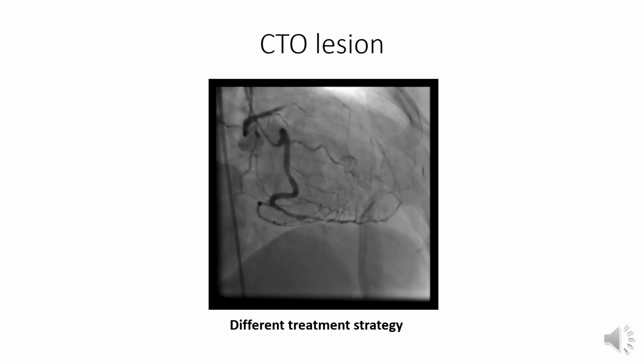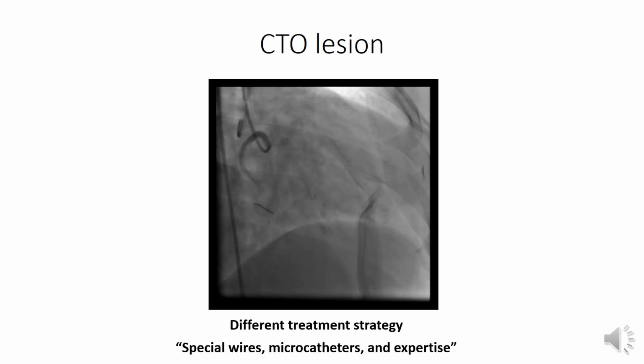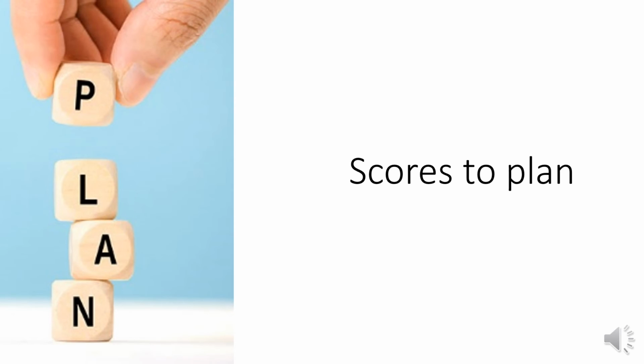This actually mandates different treatment strategies, special wires, microcatheters, and indeed expertise.